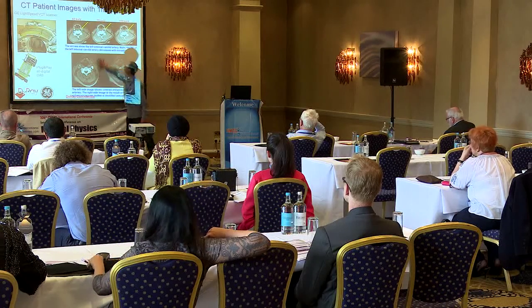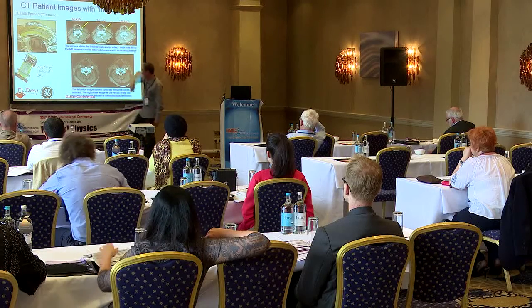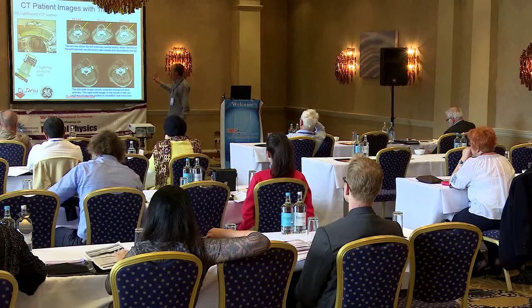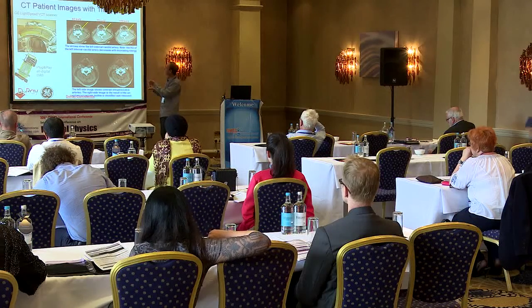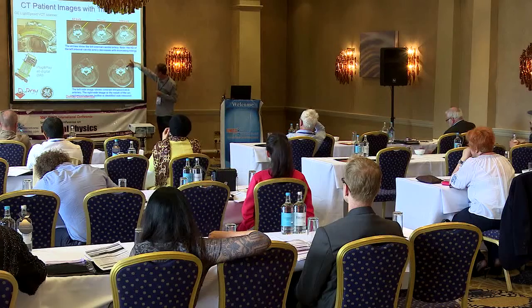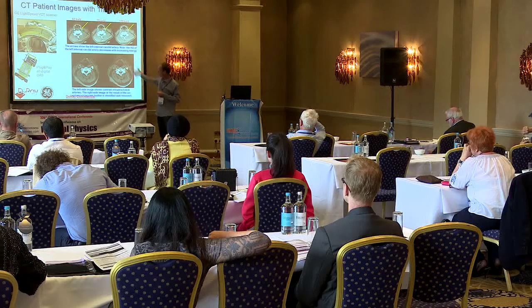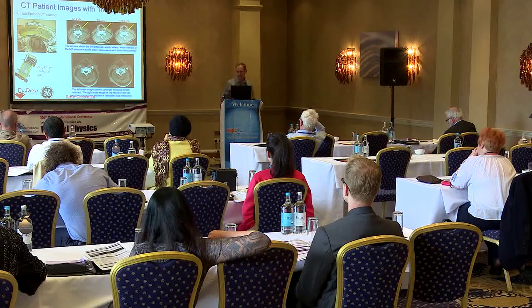This is what you would get under contrast, where you can't distinguish between the iodine and the plaque. But on the right side, we make a virtual non-enhanced image by subtracting the iodine that was identified in the energy resolved images. And you can see that this occlusion is probably not significant enough to require treatment. So that's good news for this person.